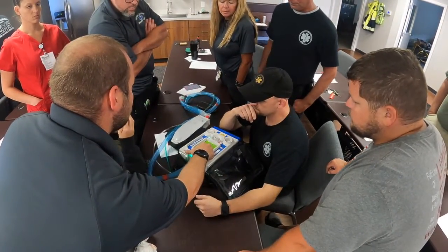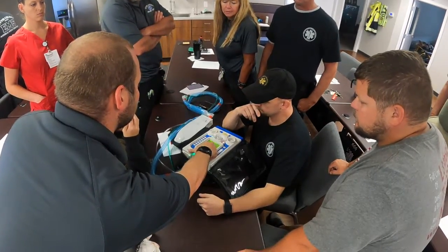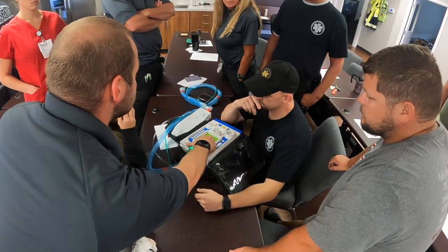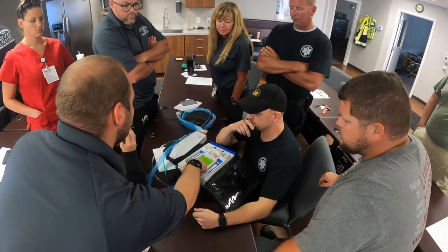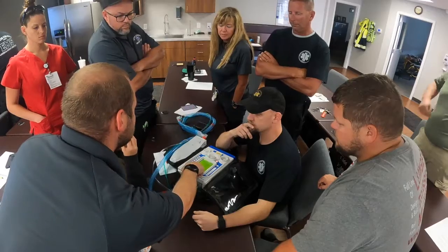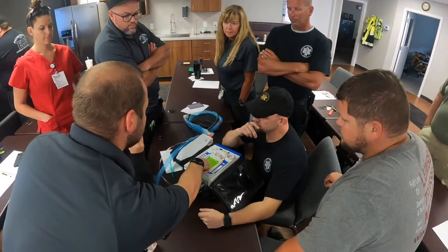Currently right now, in this mode, we do not have any kind of volume limits because we have direct control over that. If we were in pressure mode and we were controlling PIP specifically, we can set alarms for our tidal volumes.